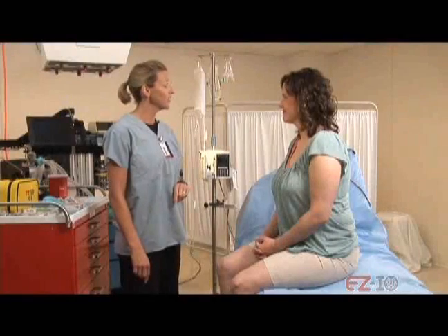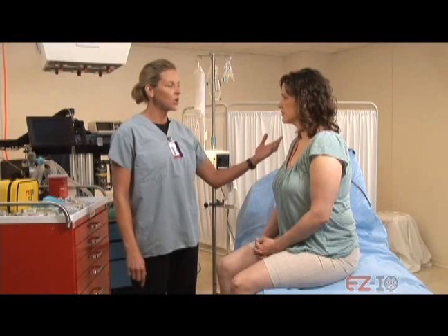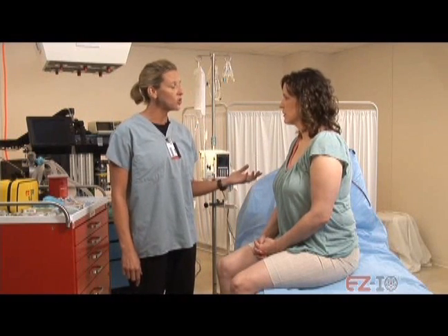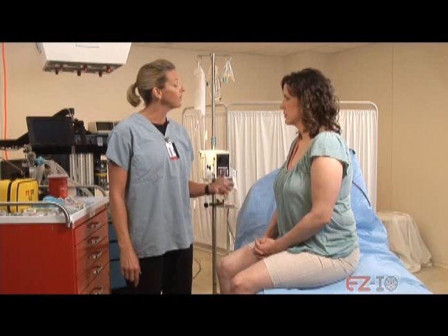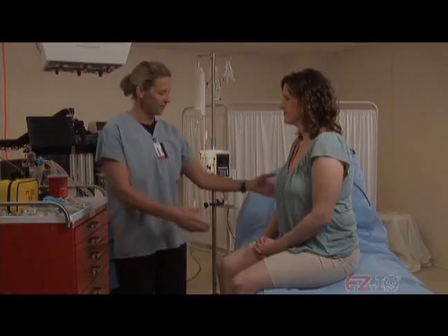Following removal of the EZ-IO, inform the patient that soreness is normal for up to 48 hours following removal and can be treated with over-the-counter pain medication. The patient should be able to assume normal activities as soon as their primary medical condition allows. Finally, if the patient detects any signs of infection or other problem, they should contact their primary care physician.